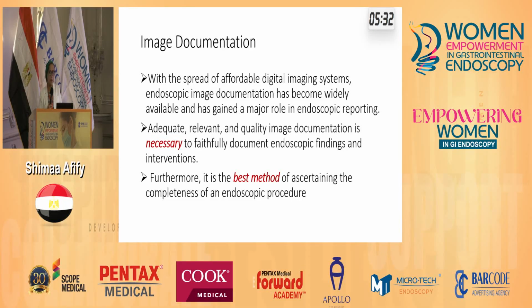The next step after I've already mastered colonoscopy is to take enough documentation by imaging. All the scopes now have digital imaging systems. They can document either by video or by just photos, so you should not waste this. You have many techniques to use with the different scopes that are being used in Egypt.